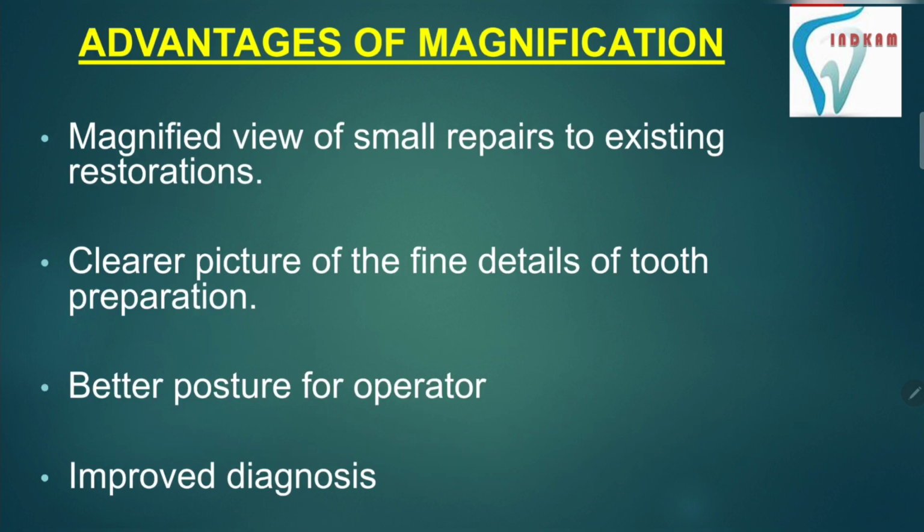So, why people are using it? If people are using magnifying instruments, there must be certain advantages to that. So, let's see the advantages of magnification. The first one is the magnified view of the small repairs to existing restorations, clearer picture of the fine details of the tooth preparation, better posture for operator, and improved diagnosis.